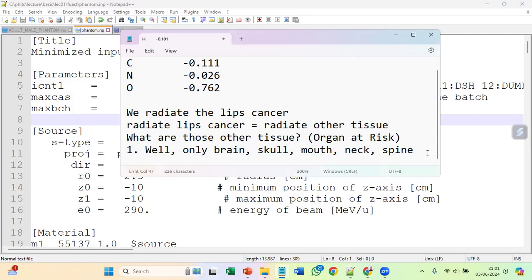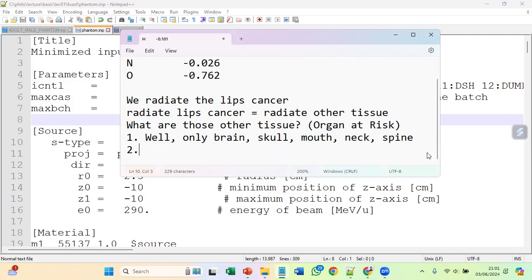But the problem occurs when the tissue is like eyes, since our phantom doesn't have eyes. Nose. I don't know. Or even some body part that we don't even know the name of, teeth probably.